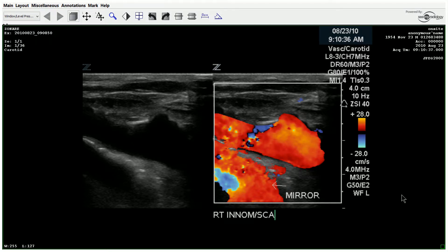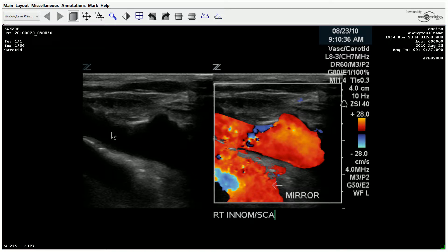We have a carotid ultrasound — a patient presented with an abnormal CTA of the head and neck. Beginning on the right side of the proximal neck, we have the innominate here and subclavian. You can see the sonographer has labeled that this is a mirror image, so it's one of those things we look out for, especially when we're low in the neck.